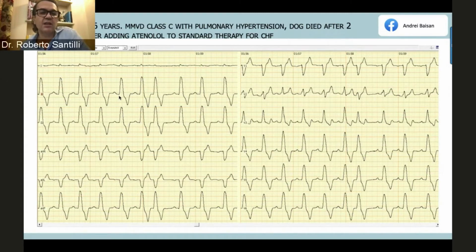When you see something like that, you have to keep in mind that the electrical impulse is going from the atria to the ventricle along the right bundle. The right bundle is a tiny bundle, and usually the vulnerability of a bundle depends on the length of the bundle and the wideness of the bundle. And usually the left anterior is the more vulnerable, followed by the distal part of the right bundle. And then you have the posterior bundle, and then you have the truncular part of the left bundle.